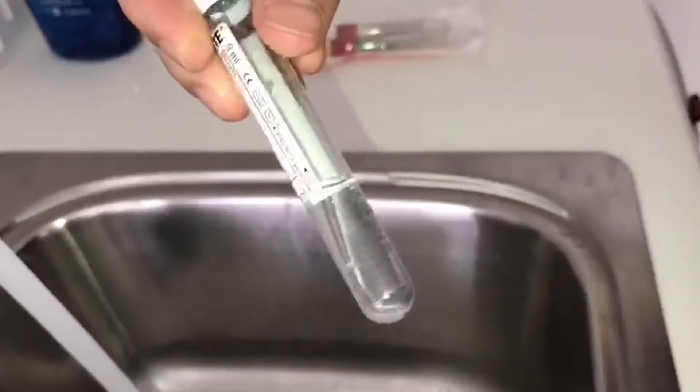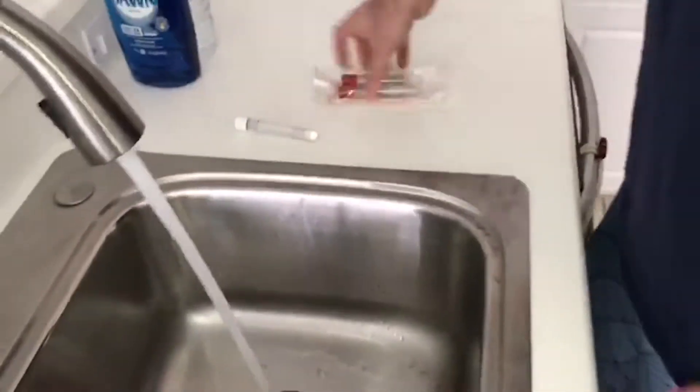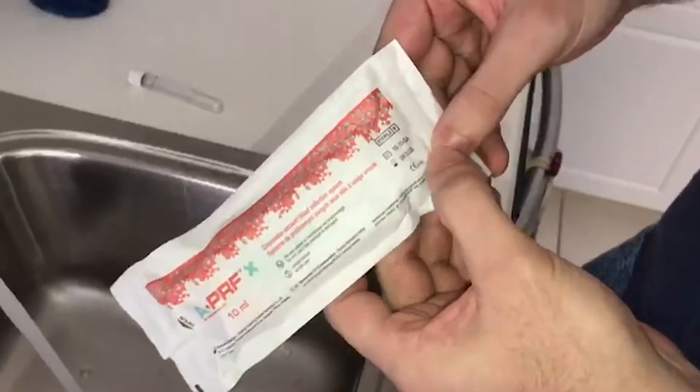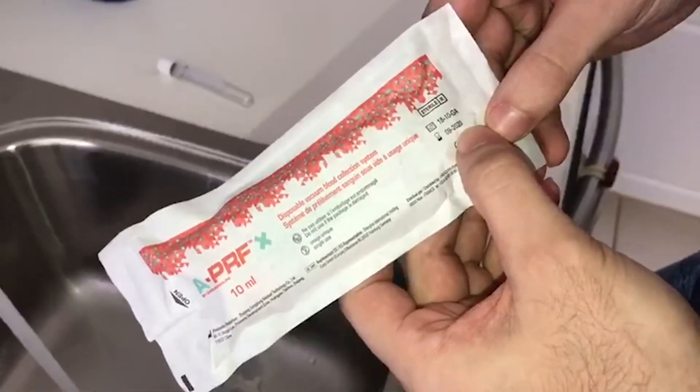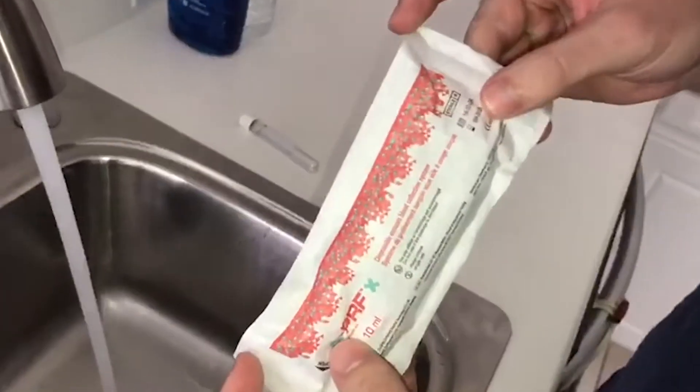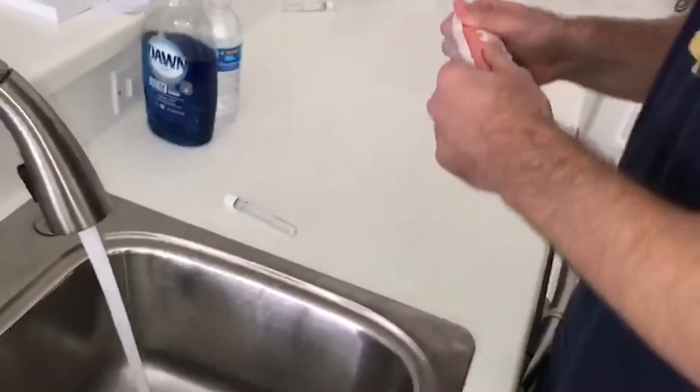Shake it — you can vigorously shake it if you'd like. And you can actually see inside the tube there's nothing obviously coming off. These are some of the plain tubes being tested here.